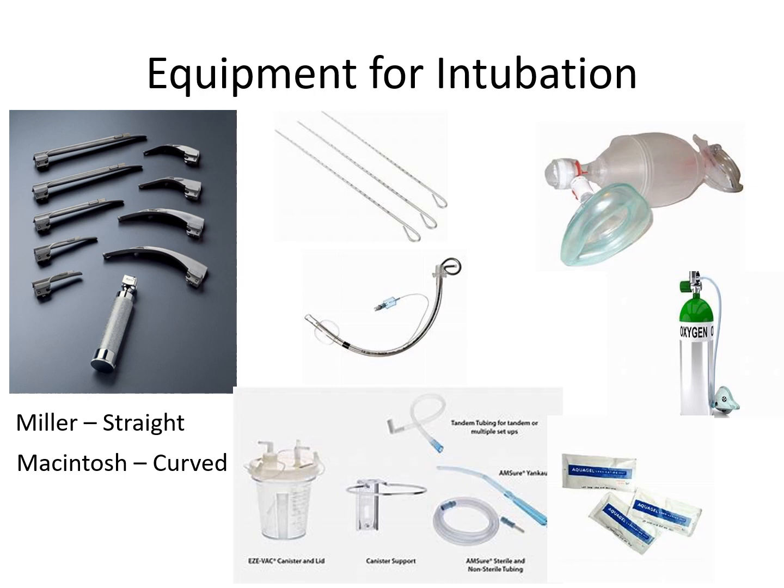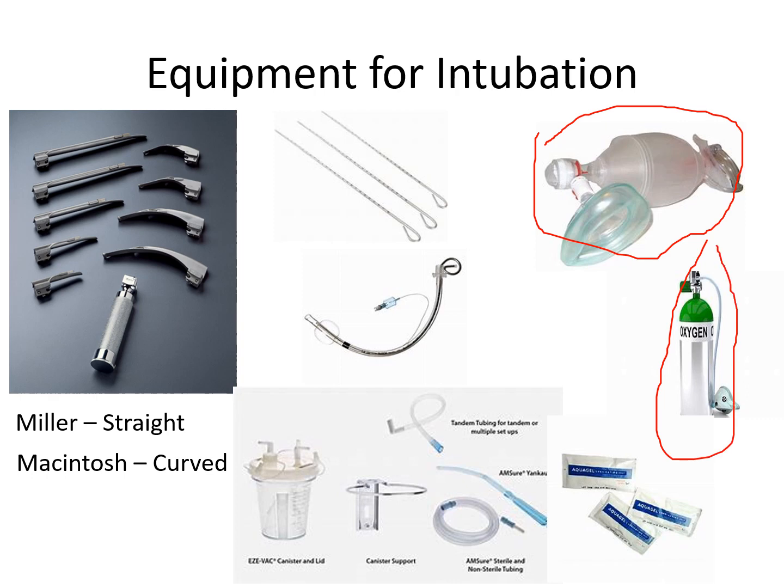For the equipment for intubation, the patient is probably already having an ambu bag and being oxygenated. The oxygen would be either from a tank or from the wall. You should turn the oxygen up to a minimum of 10 liters, up to 15 liters, in order to maintain that reservoir oxygen bag full. You would need suction, a whole setup of suction, fully functioning. Make sure that it's working.